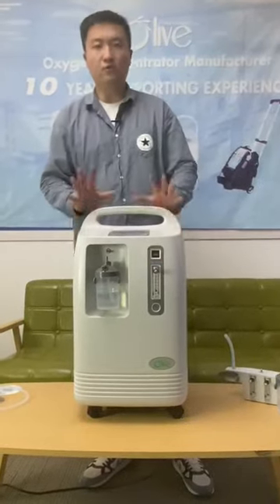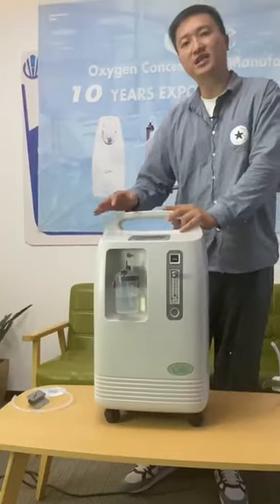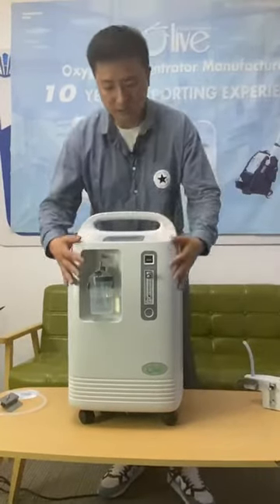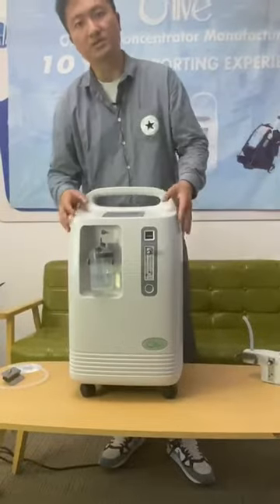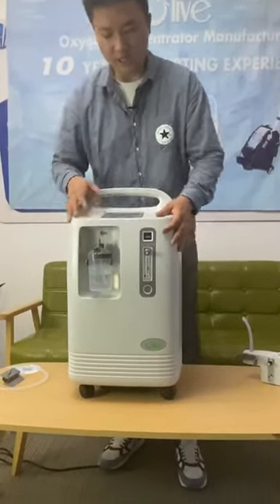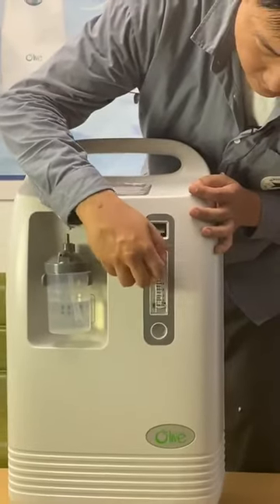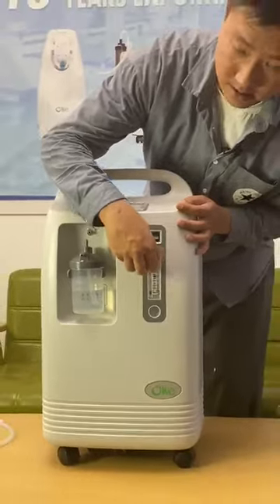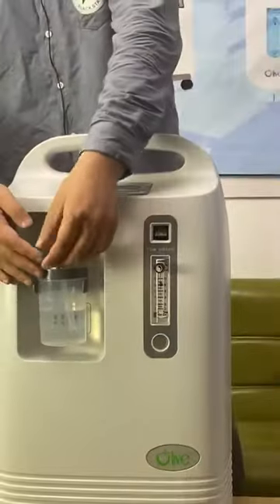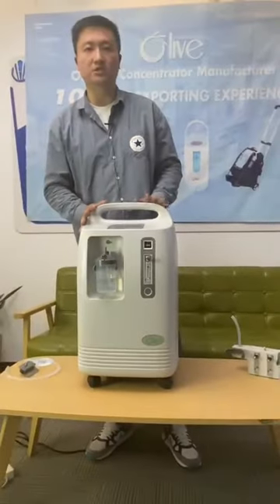This is our OLV-10NAS oxygen concentrator. This is only available in our single flow option. When you turn it on, you can see one flow meter. You can adjust the flow from 0 to 10 liters, and there is one humidifier bottle. Once you connect your nasal cannula, you can start using the oxygen concentrator.